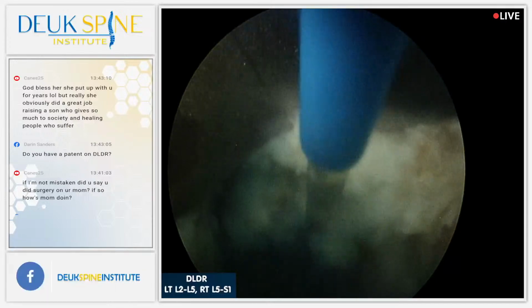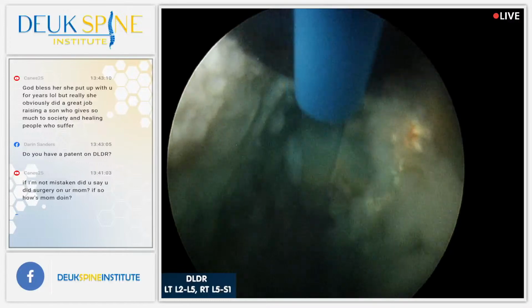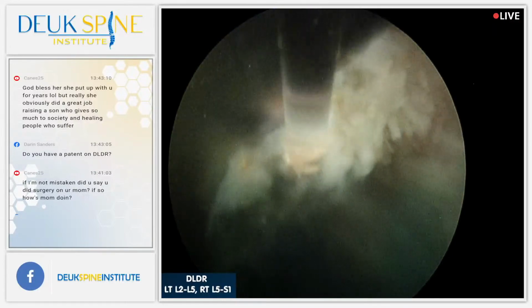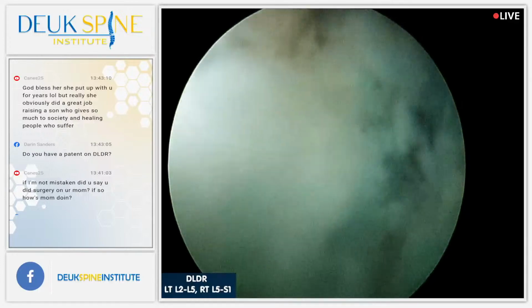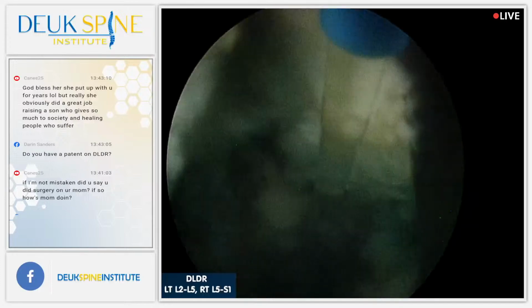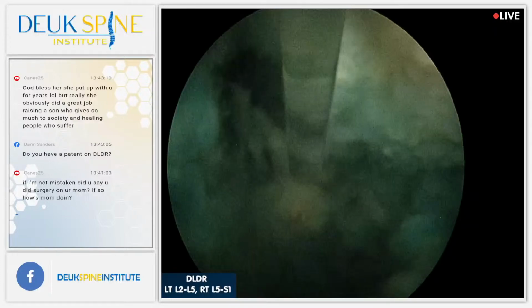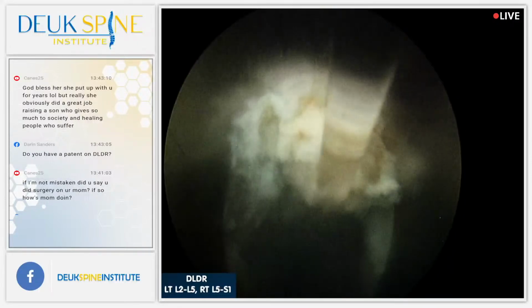All right, welcome back. And hopefully you are a little more knowledgeable about how the Deuk laser disc repair procedure works. Right now I'm using the laser to debride this tear within the annulus, and I'm looking 360 all the way around. I want to not miss anything. I'm checking everything out, making sure I get all the loose stuff out.